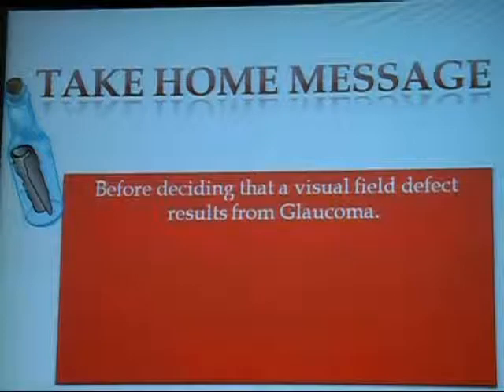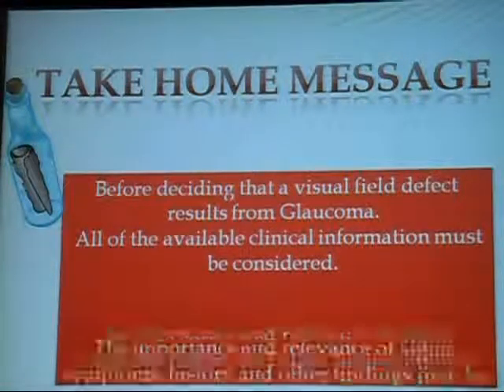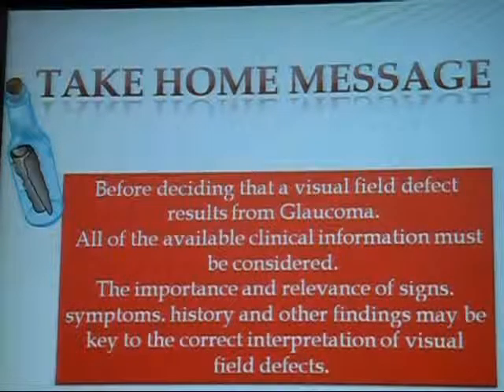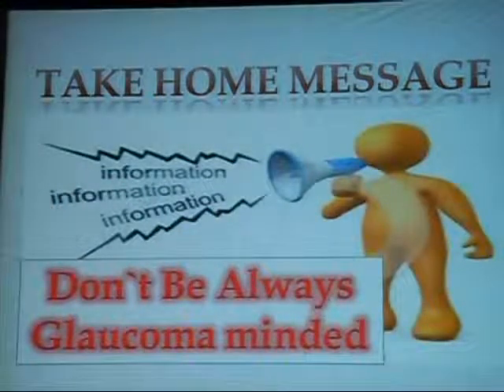So my take-home message is that before concluding that visual field defects result from glaucoma, all the available clinical information must be considered. Learning signs, symptoms, and history all aid in the interpretation of the visual field, and I shouldn't always be glaucoma-minded.